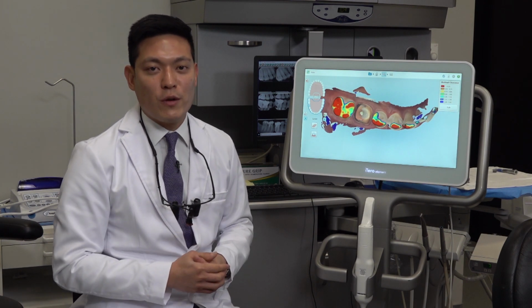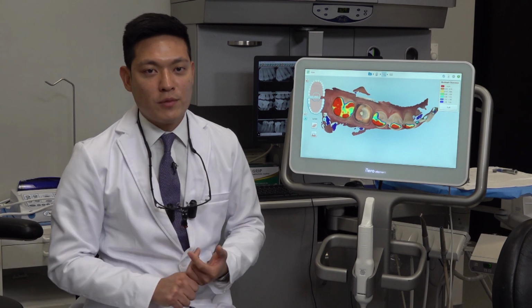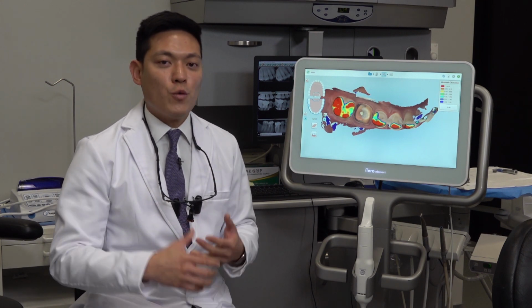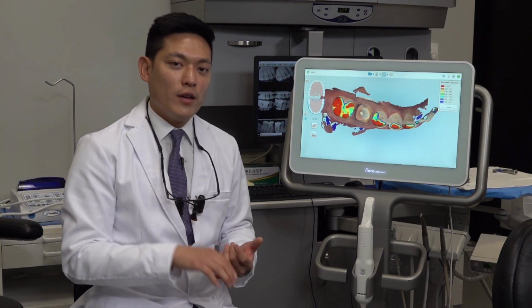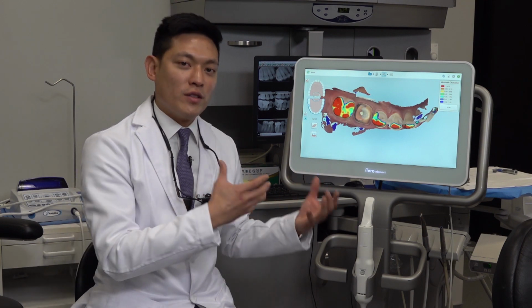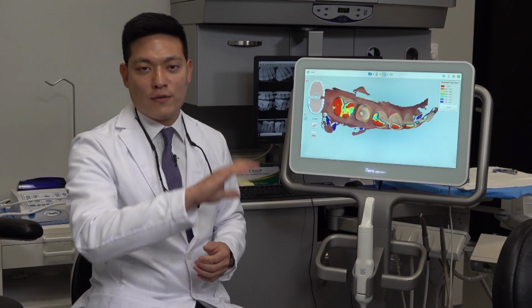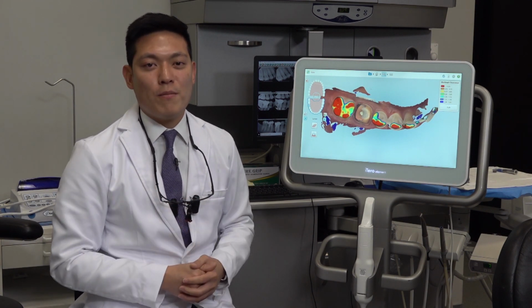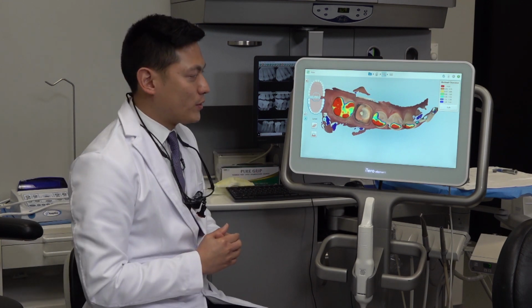Most of the materials that we use today, whether through the lab or chairside, like the lithium silicate glass ceramics, even with bruxer restorations, 1.5 millimeters is what we're shooting for to allow for adequate strength and also for the technician or the design software to create occlusal anatomy that conforms well to the patient's dentition. So it will give you more natural looking anatomy on your restorations.